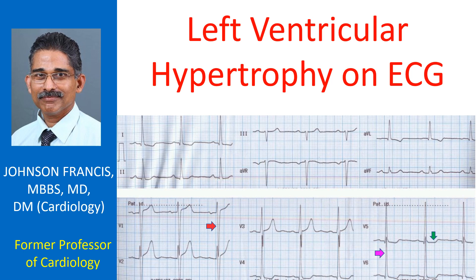Left ventricular hypertrophy is manifest in this ECG as tall R waves in lateral leads. The S wave in V1 is 2.5 mV and R wave in V6 is 2.2 mV, with a total of 4.7 mV, which is well beyond the 3.5 mV cutoff for diagnosis of left ventricular hypertrophy by voltage criteria.